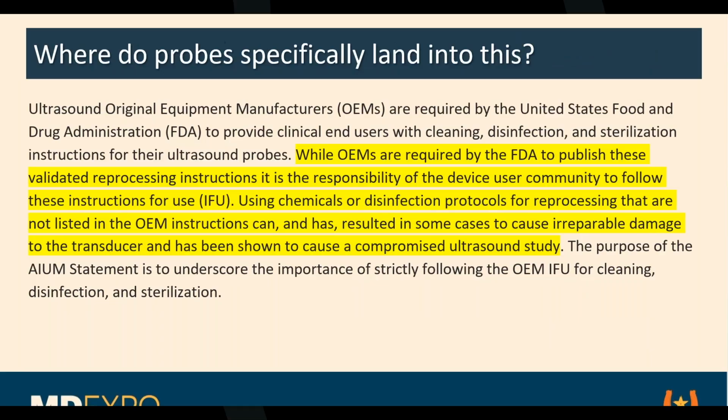So where do they specifically land in this? And this is in the original equipment manufacturer's documentation. Well, OEMs are required by the FDA to publish these validated reprocessing instructions. It's the responsibility of the device user community to follow these instructions.